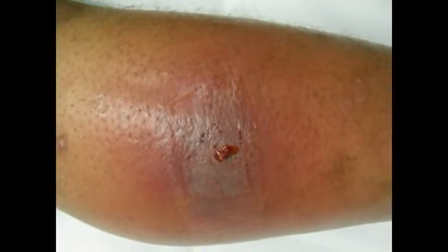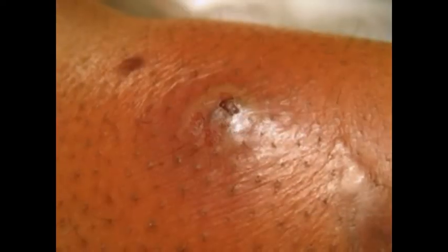An abscess that is diagnosed in one of these 3 ways may be appropriate for incision and drainage if it is larger than approximately 5 millimeters and found in an accessible location.